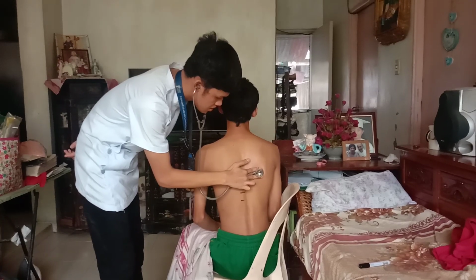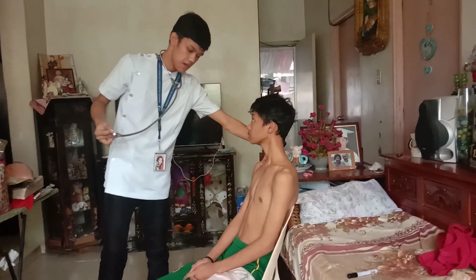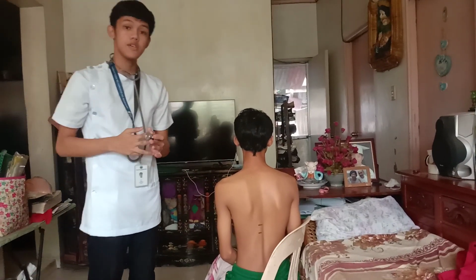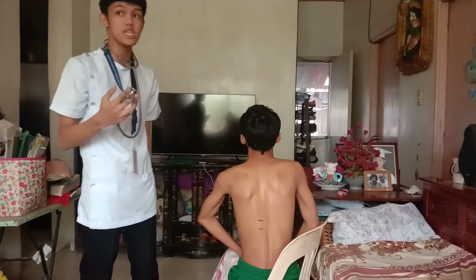Inhale, exhale. Okay, great. And now, we're going to auscultate the voice of the patient, if there is any consolidation. And now, in bronchophony, we're going to check the patient. We're going to instruct the patient to say 1, 2, 3.